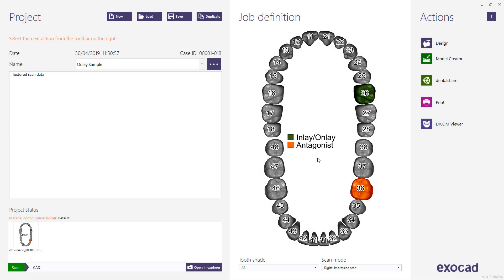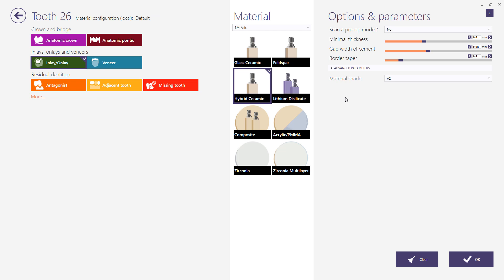This video tutorial from Exocad will show you how you can achieve an onlay or a partial crown design in Chairside CAD completed in just a few steps. We will start with one of our demo samples. The restoration type selected for this case is onlay with hybrid ceramic as the material.